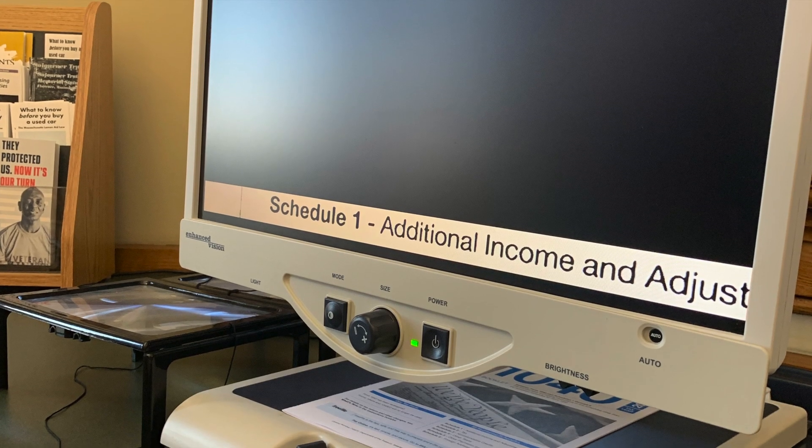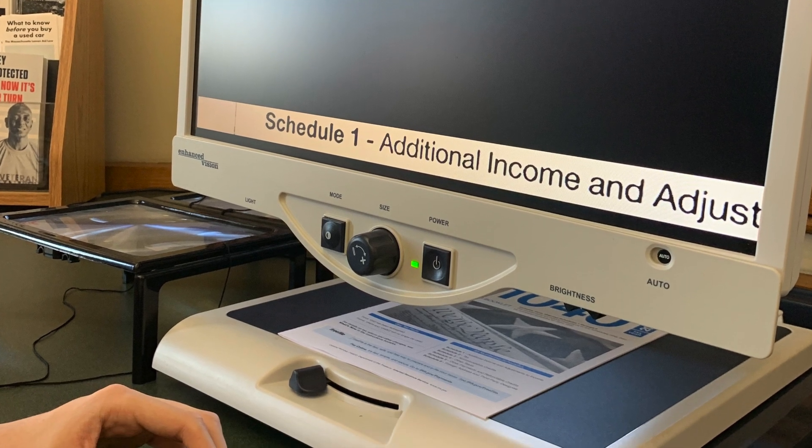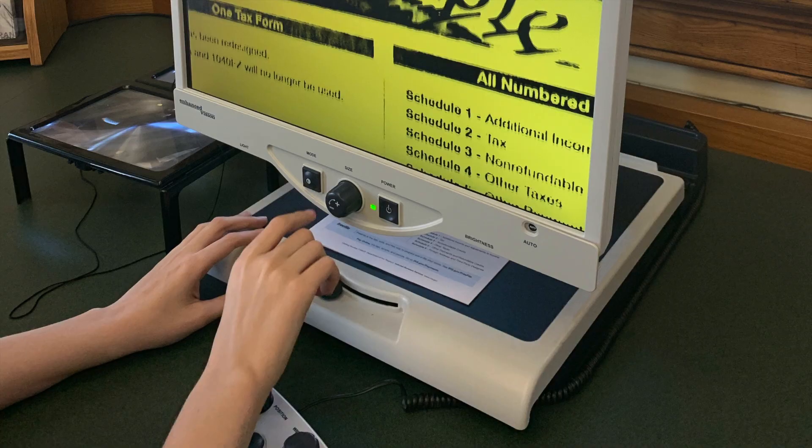If you'd like to just view what's between the lines, you can press the window button. The base where the material is set can be slid to the left and right as well as forwards and backwards, allowing the magnifier to pick up different areas when needed. The left and right movement can be controlled by a small lever at the front of the item tray.